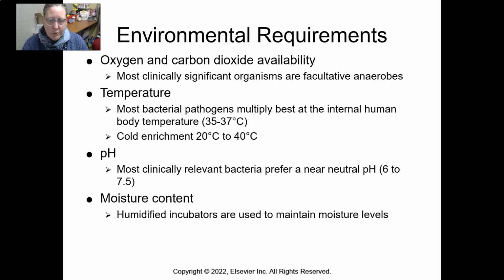Some might require cold enrichment, and at 20 Celsius to even all the way to 40 Celsius. And the pH here, so most clinically relevant bacteria prefer a near neutral pH, 6 to 7.5. Some might be able to grow at extremes of pH. So moisture contents, humidified incubators are used to maintain adequate moisture levels so the agar doesn't dry out and they have enough humidity in the incubator.